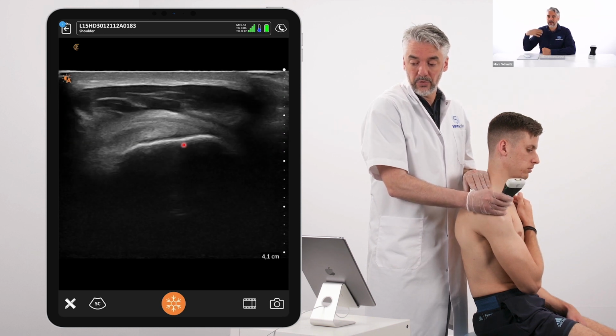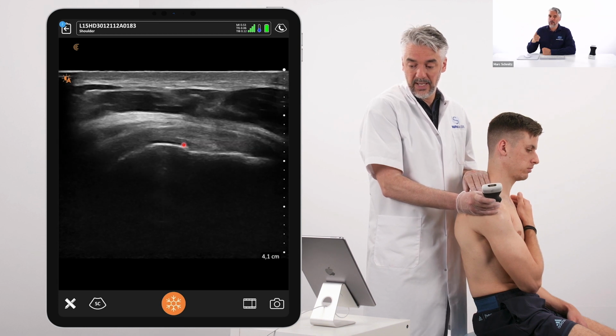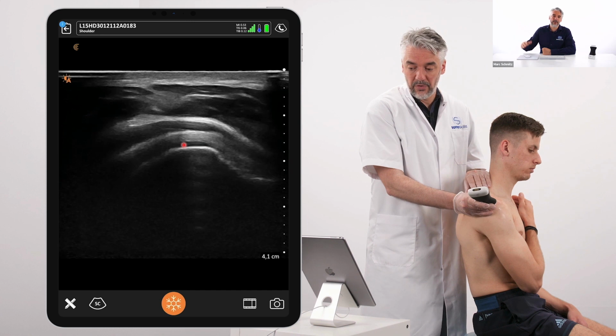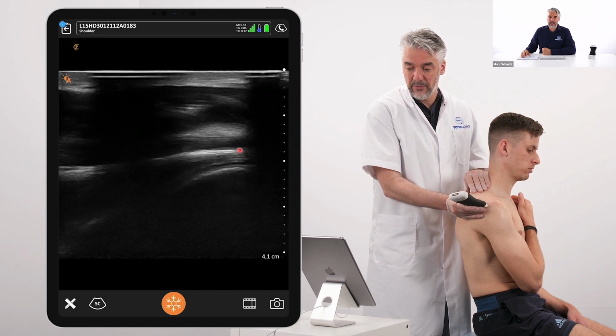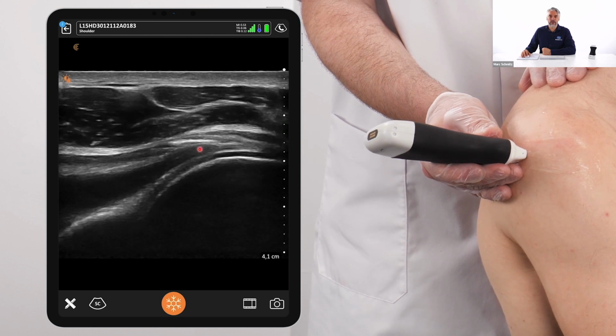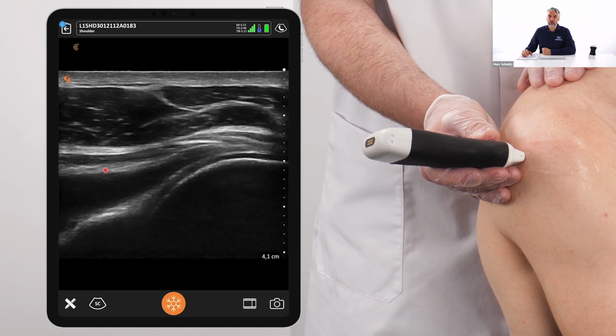Also the teres minor, look at the teres minor. I know it's not always that clinically relevant, but you might be surprised in those cases if it is. And if you don't look, you will miss it. Following the infraspinatus to posterior, looking again at the internal aponeurosis of the infra.